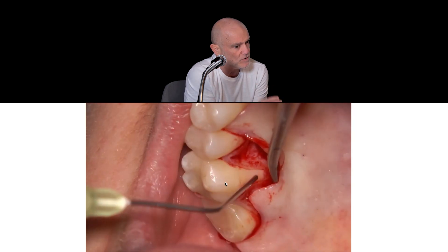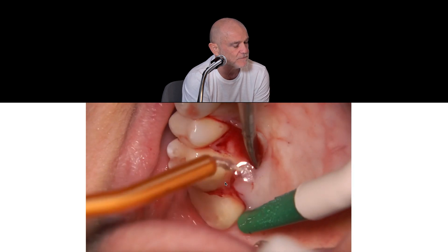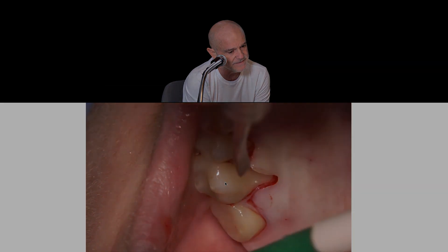All of the periosteum apical to the palatine recession has to be maintained, so I recommend we never use the periosteal elevator in the palatine flap. We do all our root smoothing procedures and application of EDTA.